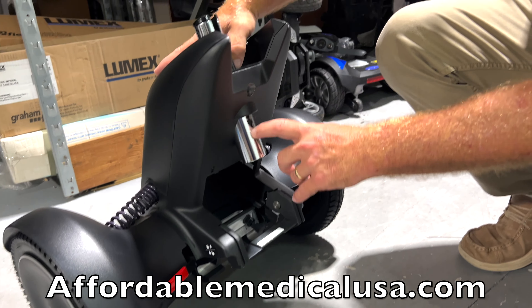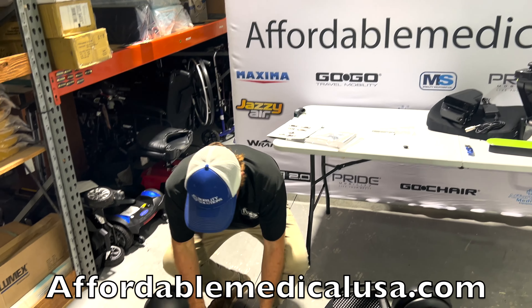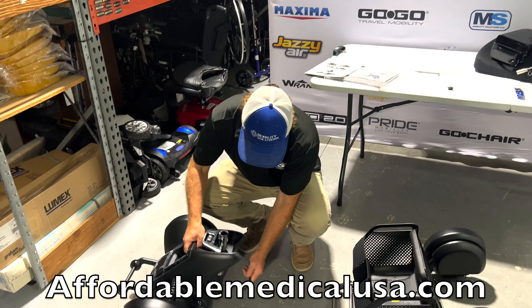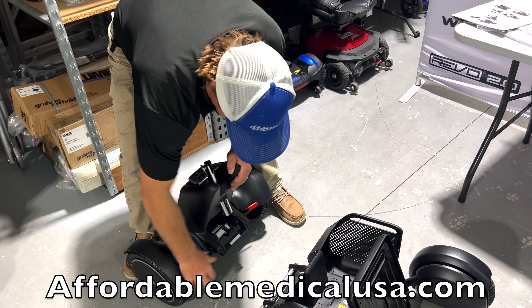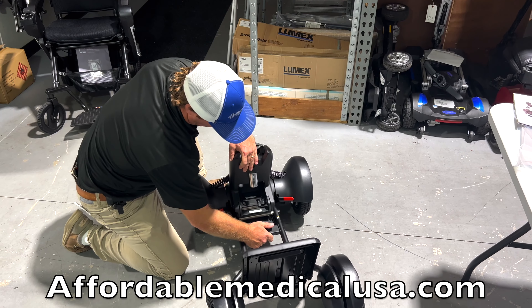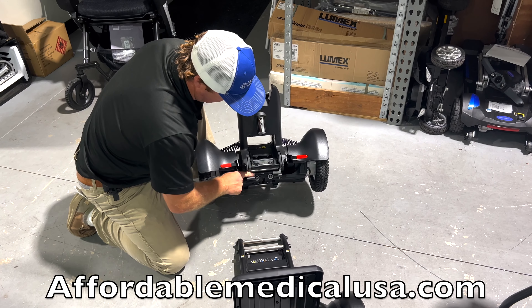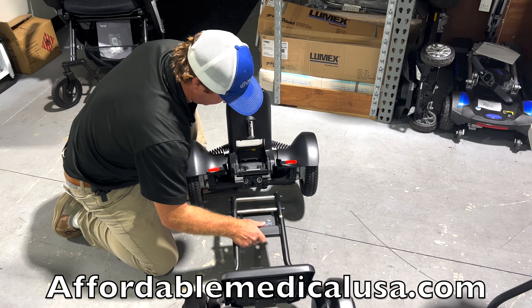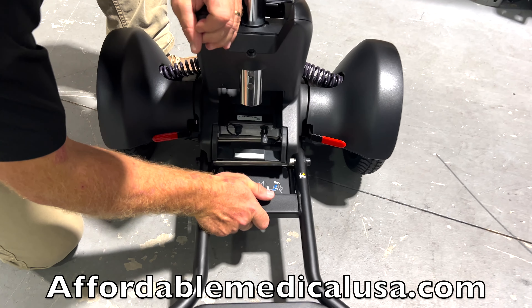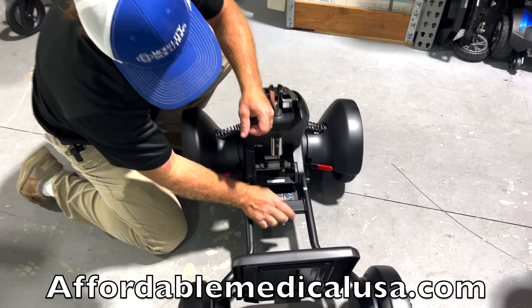You also have adjustments with the seat. You use the little tools that come with it to adjust the seat height. In the manual on the spec page, you'll be able to see the different heights of the seat. You just put this in like this, loosen it, and raise it up and down — there are a lot of adjustments with the CI2 compared to the Fi. Make sure you have these in lock for it to work. Connecting the front to the back: there's a little thing right here. With the basket off, this front bar kind of comes in and this just comes down and locks right in place. To unlatch it, you just pull that up — it's pretty simple.